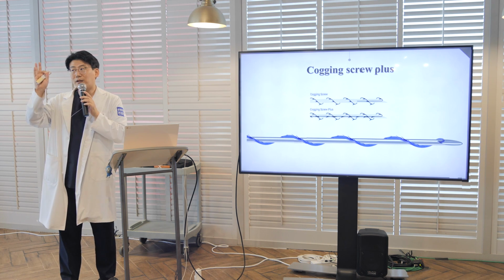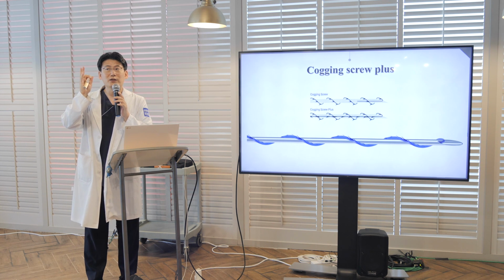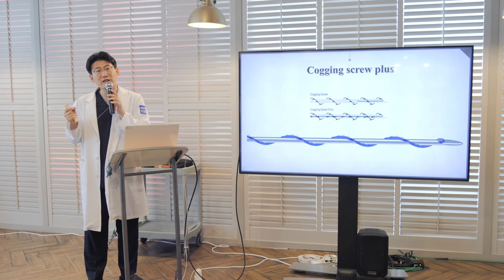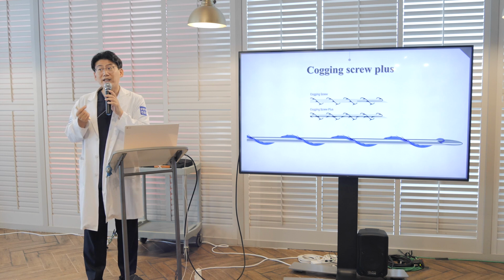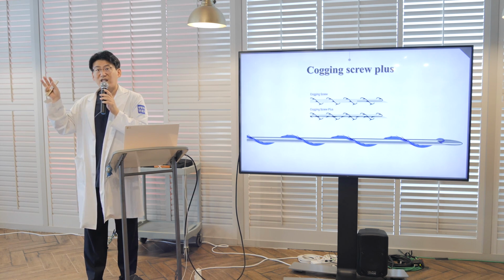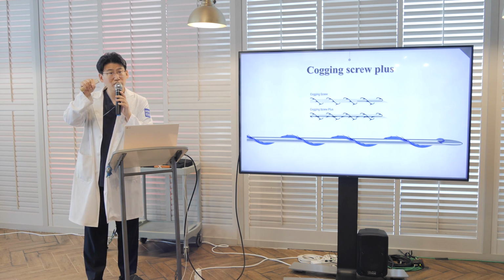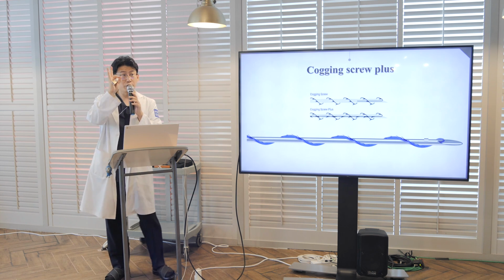Let's talk about the unit of thickness here. We usually use the unit of USP. With PDO, 7-0 is the thinnest thread. 6-0 is thicker than 7-0, then 5-0, 4-0, 3-0, 2-0, 1-0, then 0.